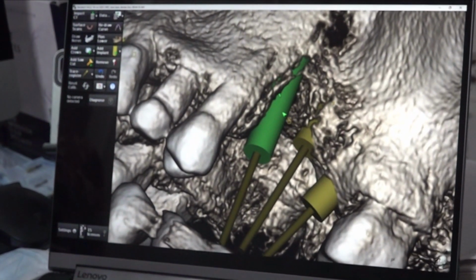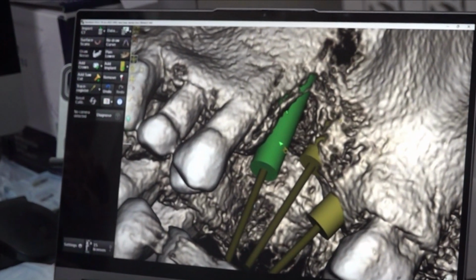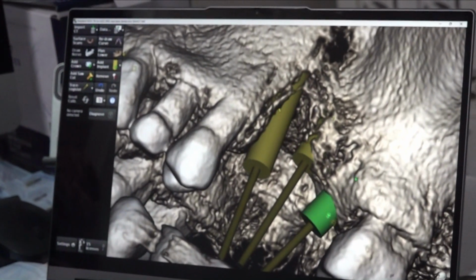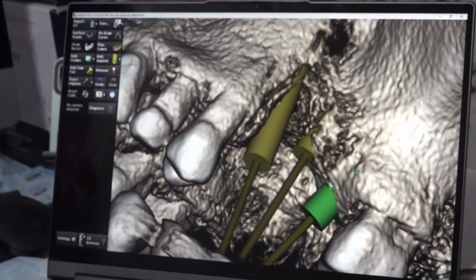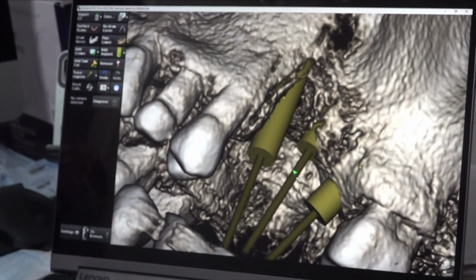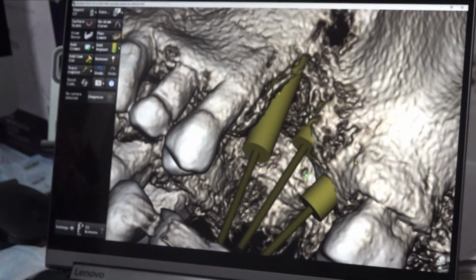However, this is a basal 3.6, but the shank here will be around 2.8, right? It won't be 3.6. If you put this as a BCS, the shank diameter will be 2.8. So inter-implant distance is not a major problem if you use a basal design or a small diameter implant.